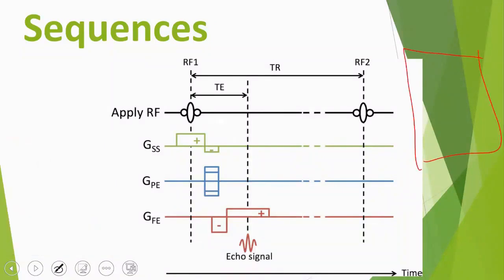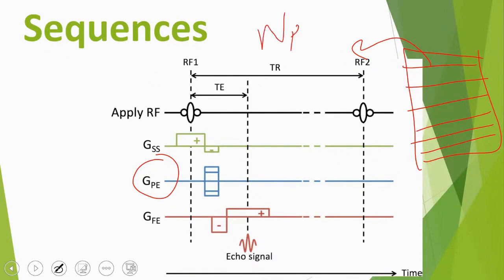My data consists of lines from a k-space, as we thoroughly discussed last time. Each row of the k-space is completely filled, once at each specific phase angle. Accordingly, if I have 256, meaning I take 256 phase steps, and my TR is in milliseconds, let's say 500 milliseconds, so I have 256 repetitions in total, and you decide your repetition time, TR.